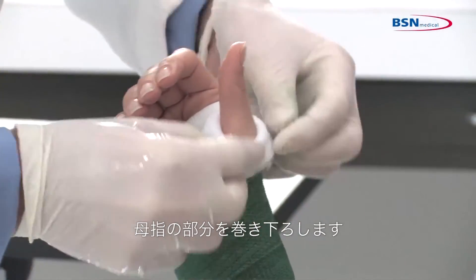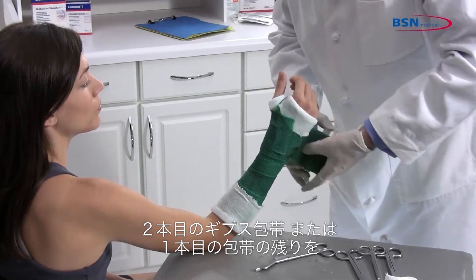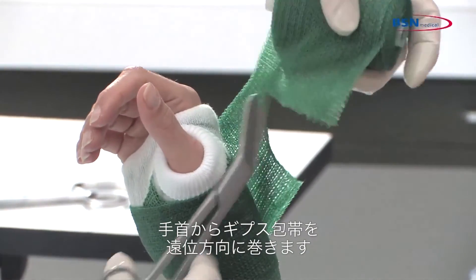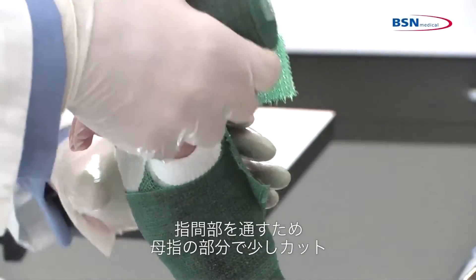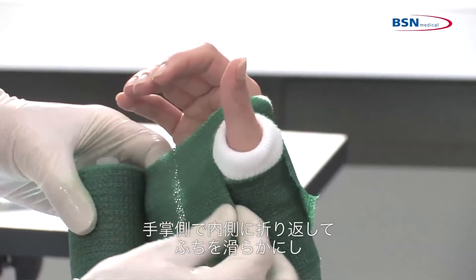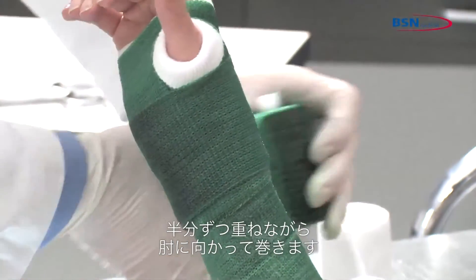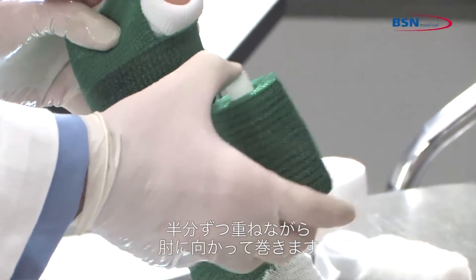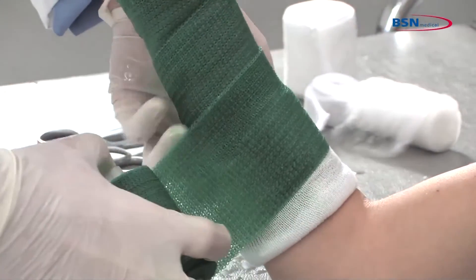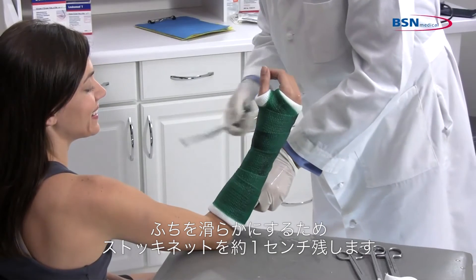Roll down the stockinette at the thumb. Now take a second roll or use the rest of the first roll of cast tape. Start wrapping the cast tape at the wrist working distally to the hand. Make a cut at the thumb to easily pass through the web space. Curl the cut edges of the cast tape under to create a smoother edge. Continue working toward the elbow, overlapping 50%, being sure to leave approximately ½ inch of stockinette exposed to leave a soft end.